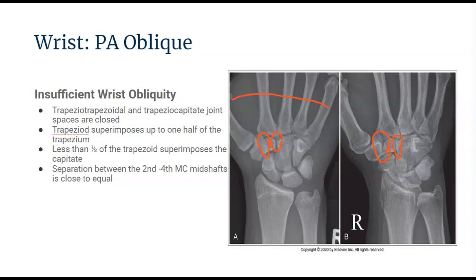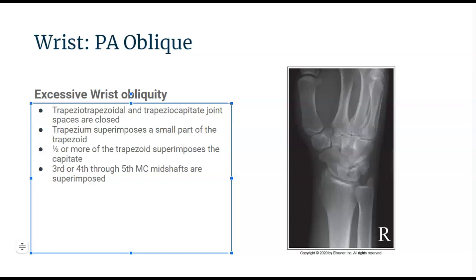This articulation — more characteristic of a PA projection — is open where it should be closed. The first projection shows less than 45 degrees of rotation, probably around 10 degrees, whereas projection B is probably just shy of 45 degrees, maybe in the 20 to 30 degree range — not quite sufficient rotation. Please refer to part two for excessive wrist obliquity.